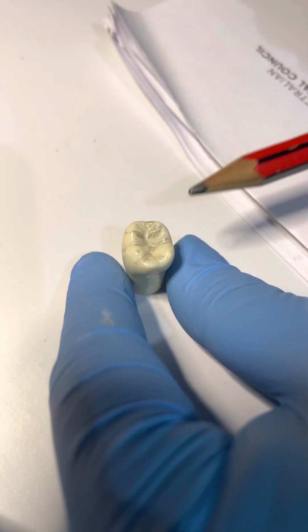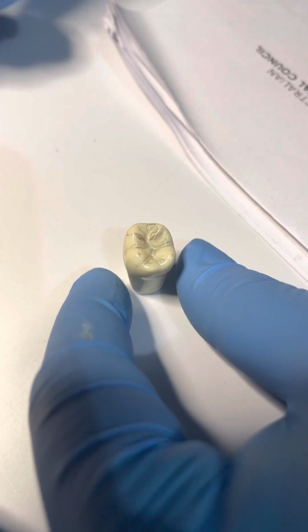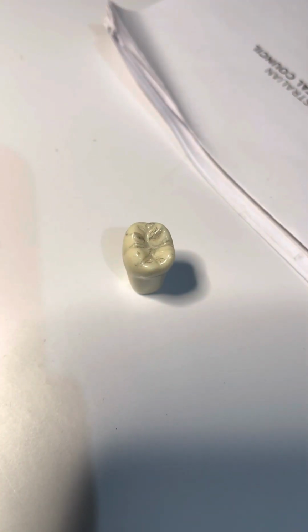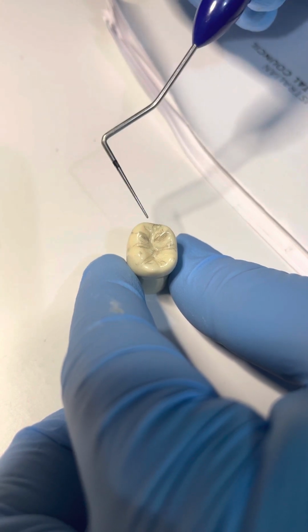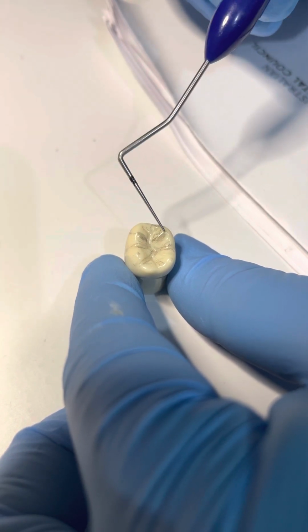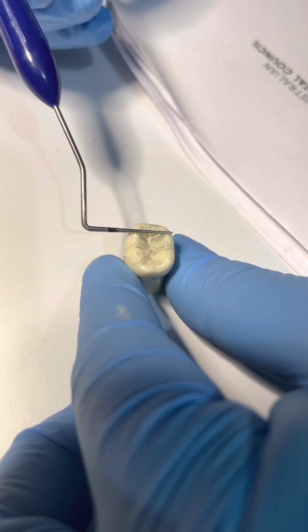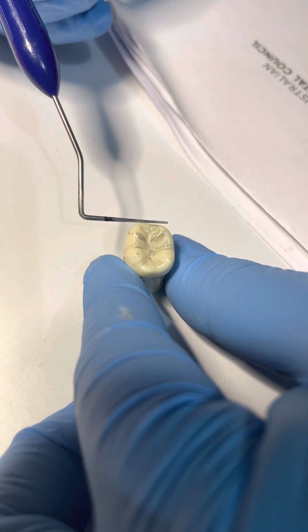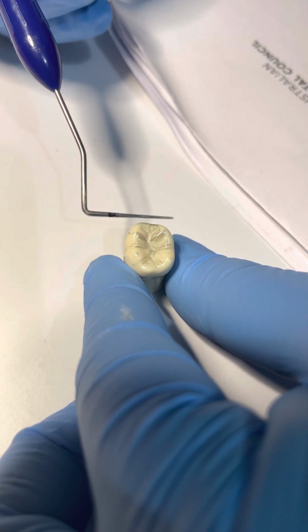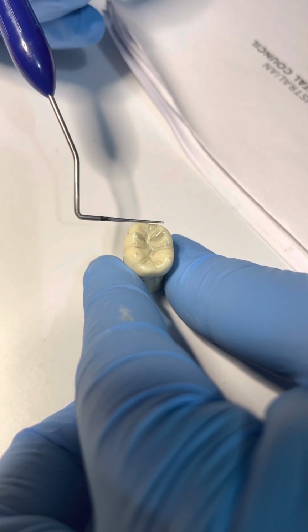Another anatomy we have to remember, according to criteria, is cusp tip and cusp positioning. In the lower first molar, the mesiobuccal and mesiolingual cusp tips are in the same line, and they are parallel to the marginal ridge. Your mesial marginal ridge is your reference point, and if you replicate the probe and bring it here, you will find that these cusp tips are parallel to the mesial marginal ridge.